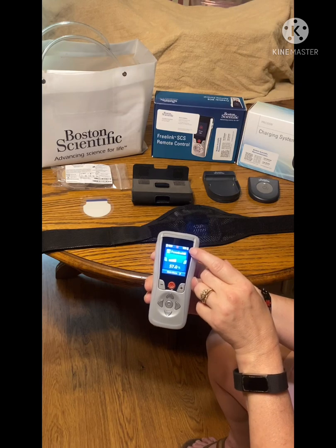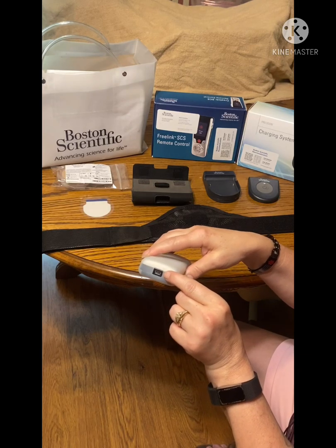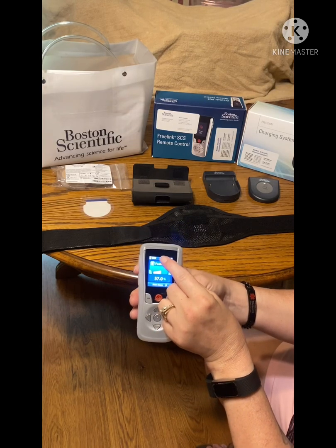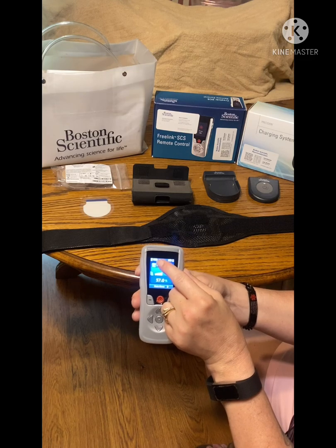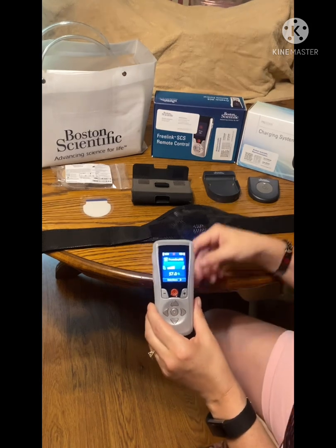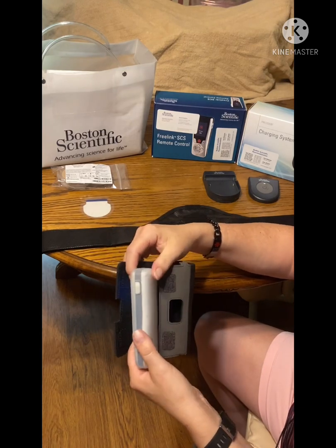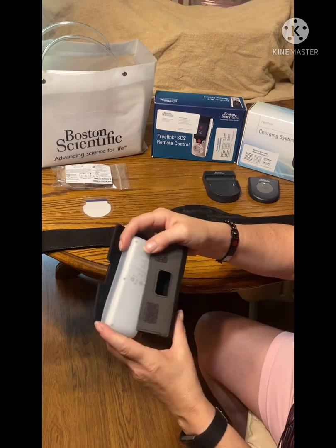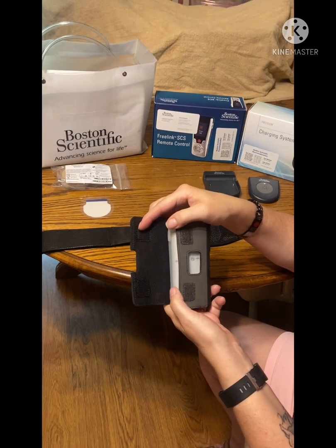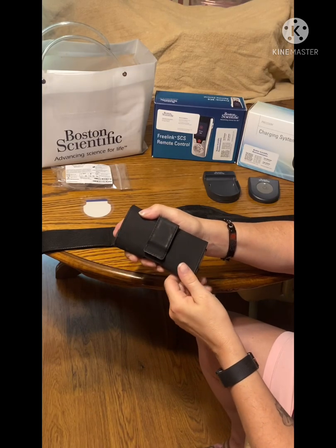It comes with a charging cord, basically like a cell phone, and you plug it in right here to charge it. It'll come on and say that — that's for this one right here for the remote itself, and this is for what's in me. Then you have the case that comes with it right here. I usually put it in this way so I can't accidentally push any buttons — just like that — belt clip or however you want to use it.